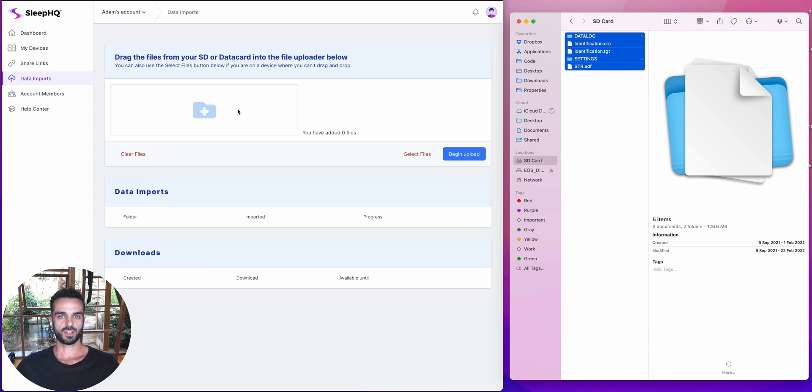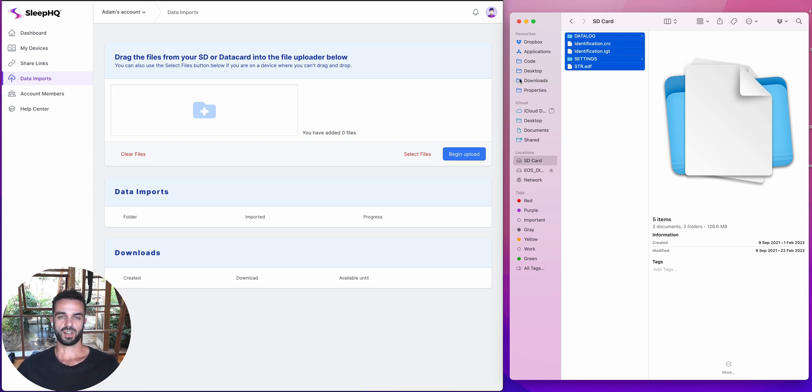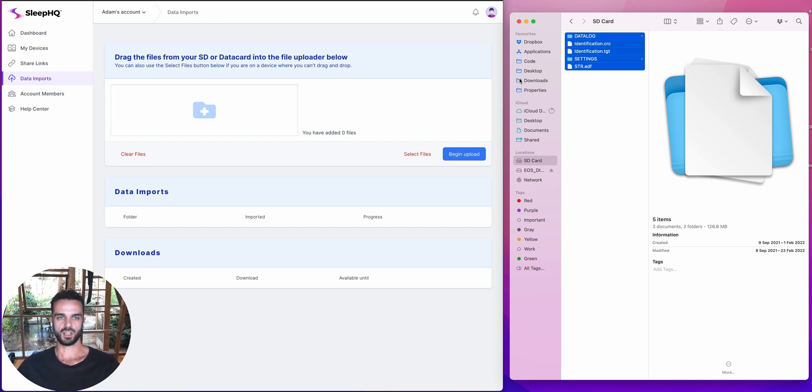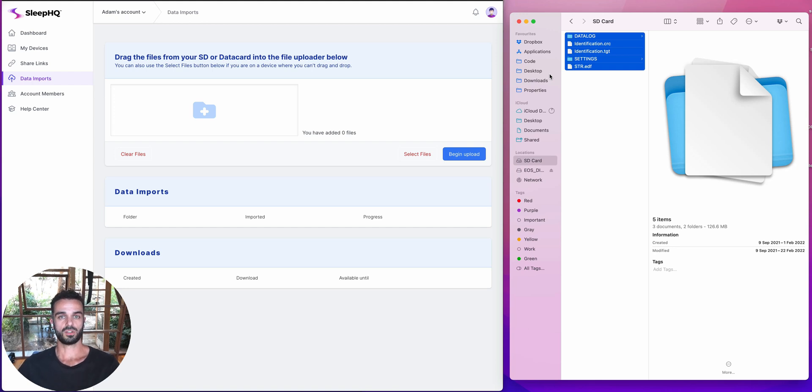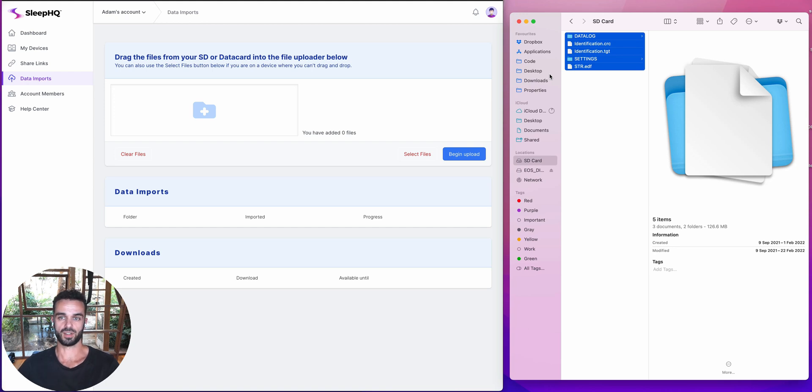So that's going to work for 90% of the people out there. If you've got a lot of data on your SD card, like if you've been using your CPAP machine, the same one for two or three years, then you might have a lot of data. Like you could have two or three gigabytes worth of data on your SD card. And that's a lot of data for a browser to have to ingest at one time. So what you can do if that's your situation is you can break that upload up into smaller chunks. So I'm going to show you how to do that now.